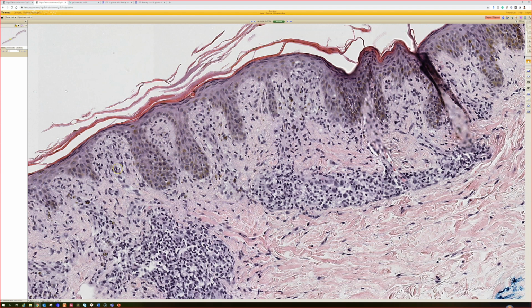I feel like in most cases of syphilis I've seen, I get that interface pattern of inflammation, but without the actual dying keratinocytes. So I find that helpful. A lot of times you get a lot of lymphocytes trickling up into the epidermis also, but again, without dying keratinocytes to go hand in hand with it. So the psoriasiform elongation plus a kind of lichenoid band, think of syphilis.